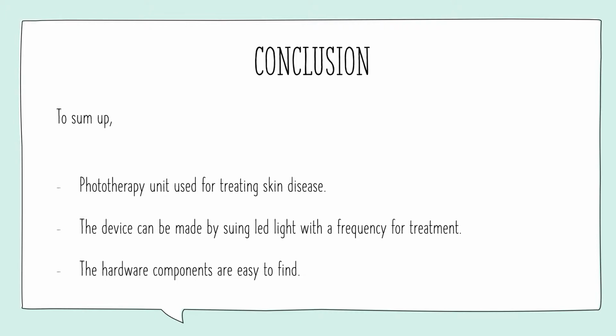In the device, there are two sensors, a load sensor and a heat sensor. Also, a webcam for monitoring the baby.